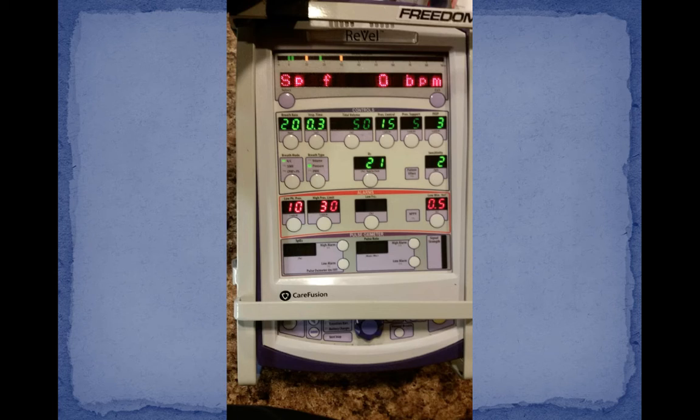Remember, again, it defaults to pressure, but it's pressure AC, so we have to switch that from AC to SIMV, and your pressure support box will light up to a pressure-supported breath of 5 centimeters of water. You have a FiO2 of 21%, so you're going to have to kick that up as well. Low minute volume alarm is to half a liter per minute, because these little baby lungs are going to create smaller volumes. Same rule as your infants.